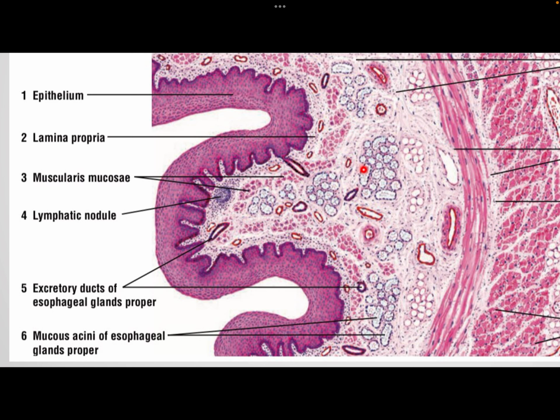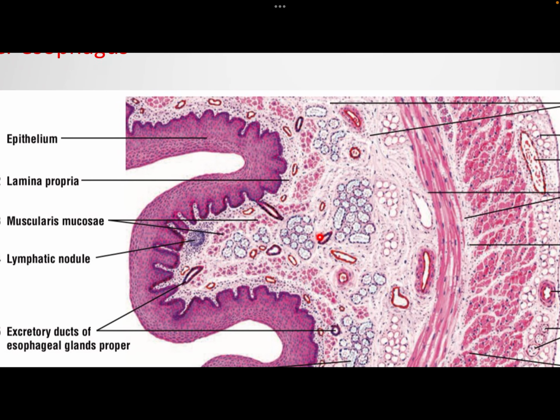Again, it's the same idea. We see venules, we see arterioles. How to differentiate between them needs to be in the basic histology. All right, and you see glands. They look like flowers. And how do I know that this is a gland? Because they are filled with mucus secretion, and in the histological preparations we use alcohol and ingredients that hydrolyze all these fats, so it gives you at the end of the day empty, white cells, but I can still see the boundaries of the cells and the nuclei of the cells. All right, so these are basically the glands.